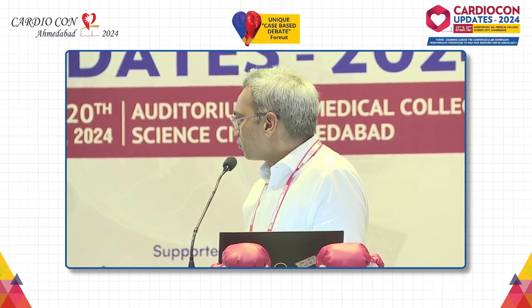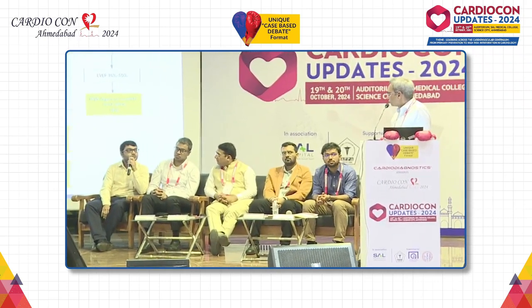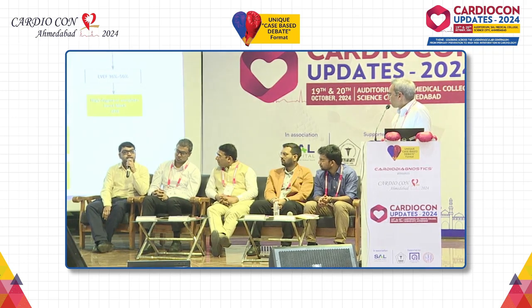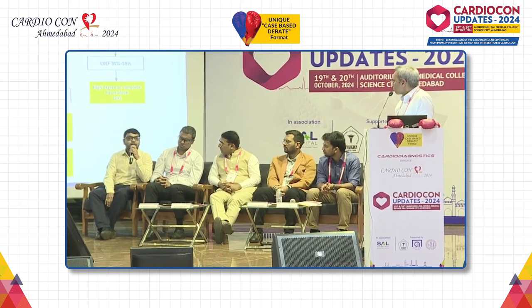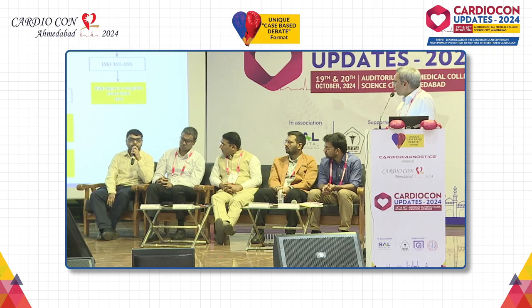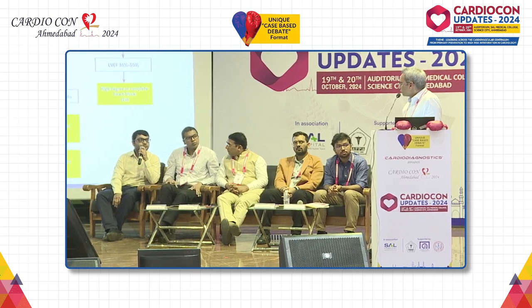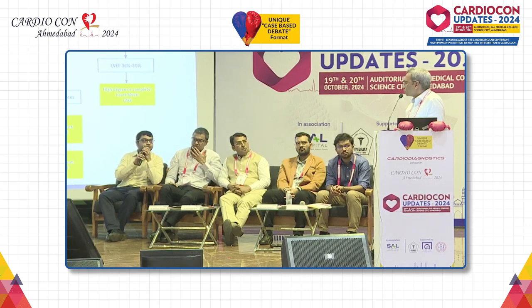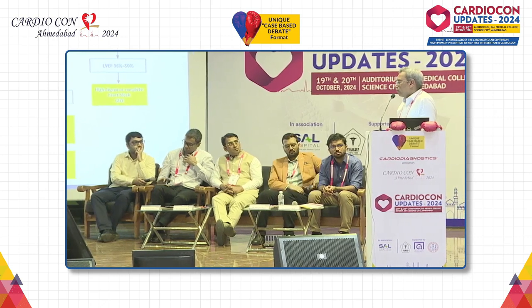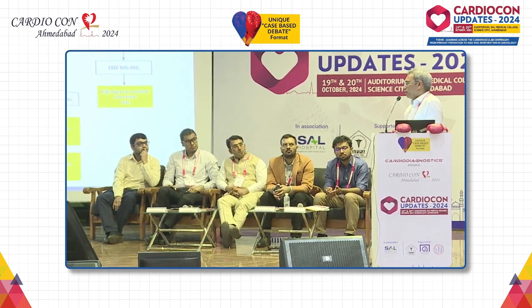And sir, besides the HV interval, I think we can also see the left bundle to ventricular activation time. If it is prolonged, then it will also indicate that it is actually myocardial disease which is contributing to this. In that case, besides placing the left bundle lead, we can place a CRT lead also, because we don't know how the disease will behave in future. So in that way, we can put in a BiV CRT and ensure that the patient does not require an upgradation in future. Yeah, it is always safe to combine two therapies. You can always put a left bundle lead.